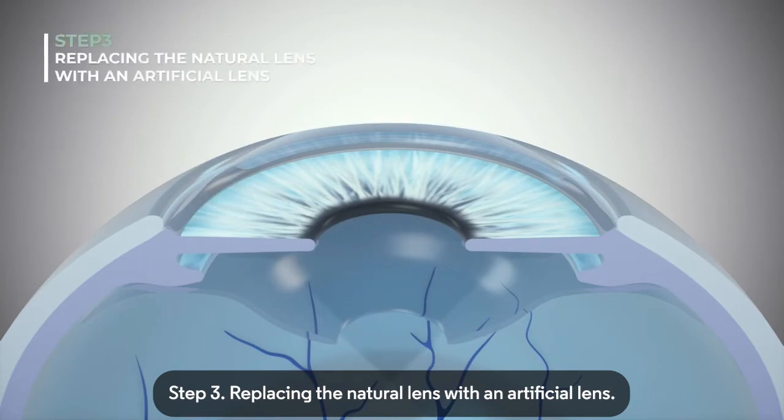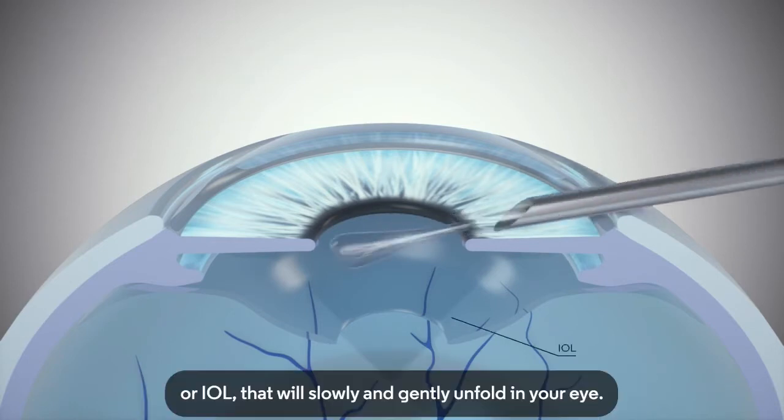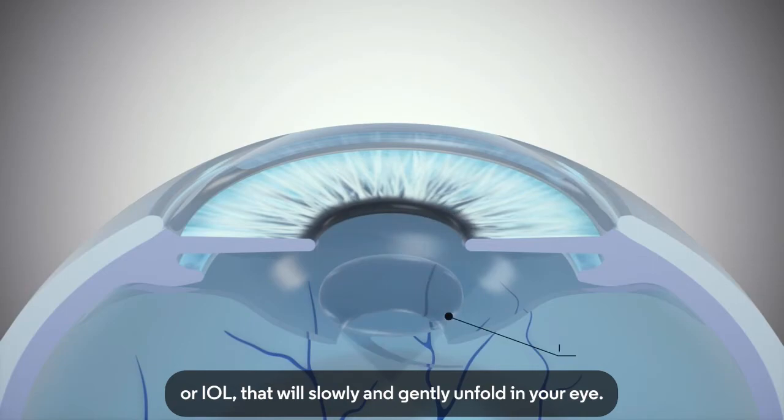Step 3: Replacing the Natural Lens with an Artificial Lens. The optometrist will insert a small, rolled-up intraocular lens, or IOL, that will slowly and gently unfold in your eye.